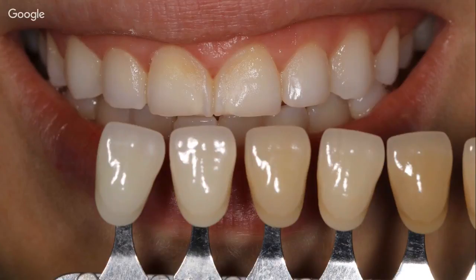And I think in this case, I've performed the most conservative treatment. A really non-conservative way of executing this case would be full mouth rehabilitation or 10 upper veneers. That would be the worst way for a young patient. So the treatment was really conservative, simply bleaching of all the teeth and then 2 composite restorations on the central incisors.